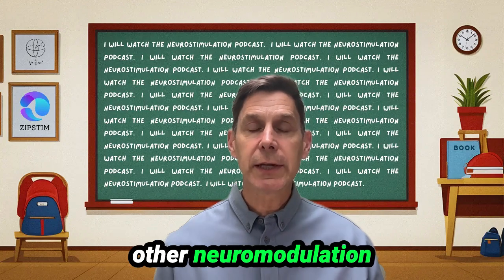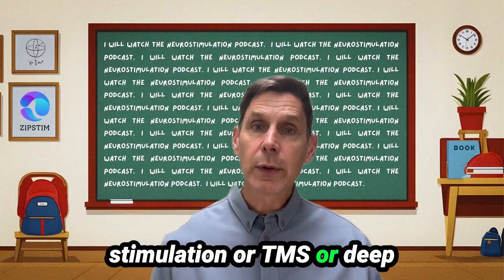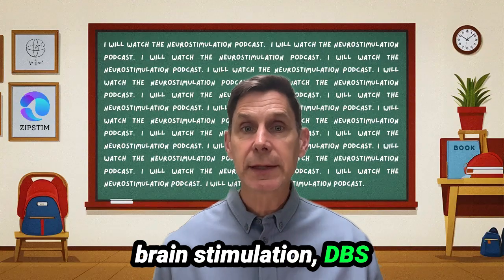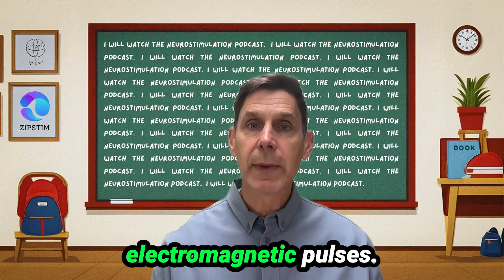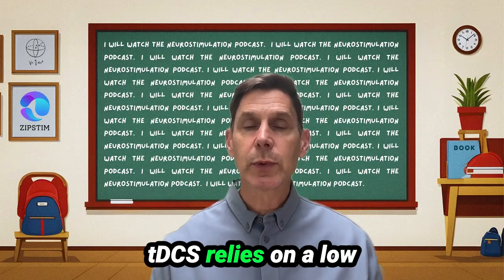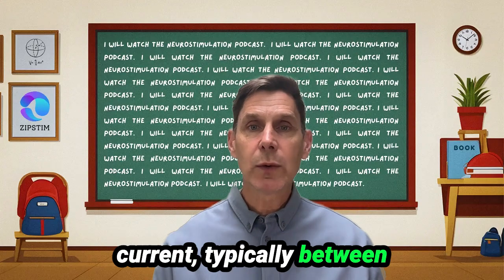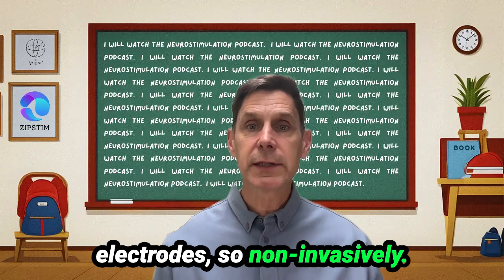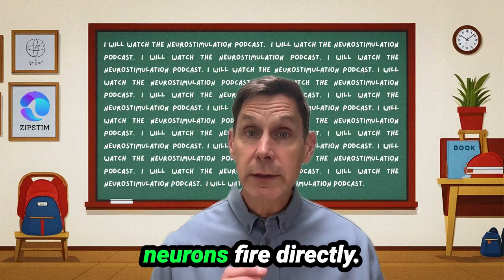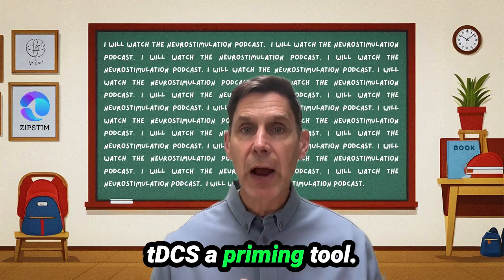While other neuromodulation techniques like transcranial magnetic stimulation, or TMS, or deep brain stimulation, DBS, require complex equipment and intense electrical or electromagnetic pulses, tDCS relies on a low amplitude, constant electrical current, typically between 1 and 2 milliamperes, delivered through scalp electrodes, so non-invasively. It doesn't make neurons fire directly, but it makes them more or less likely to fire. This essentially makes tDCS a priming tool.